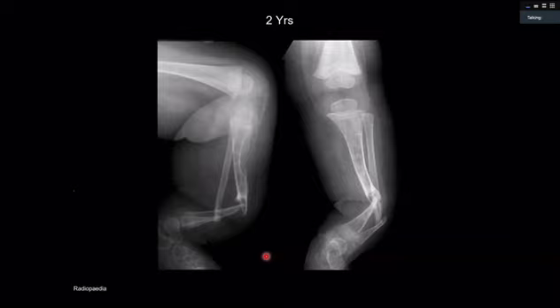They get tibial bowing and pseudoarthrosis. Yeah, very good. Pseudoarthrosis is a good answer. In this particular case, it is quite pathognomonic of pseudoarthrosis. There can be so many causes of pseudoarthrosis, but once you know the whole of the history and everything else, and look at the appearance.